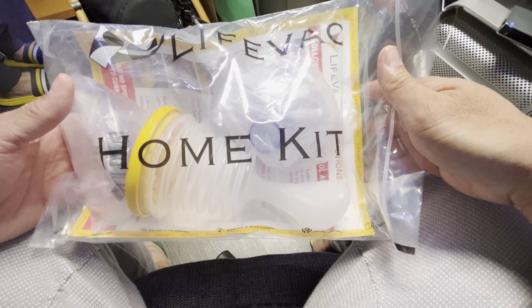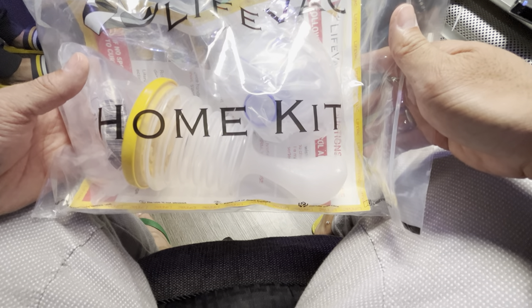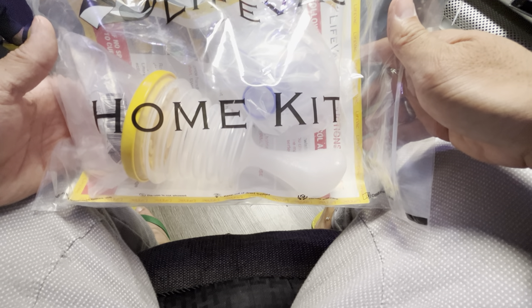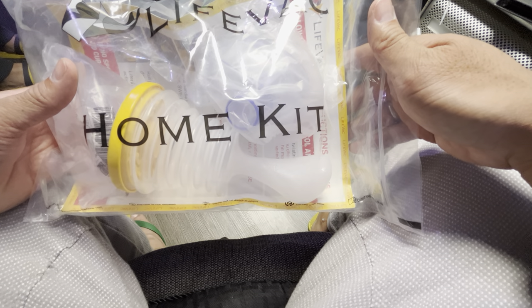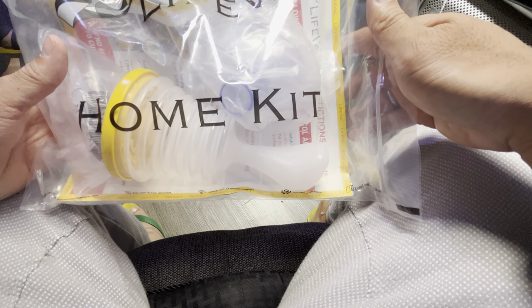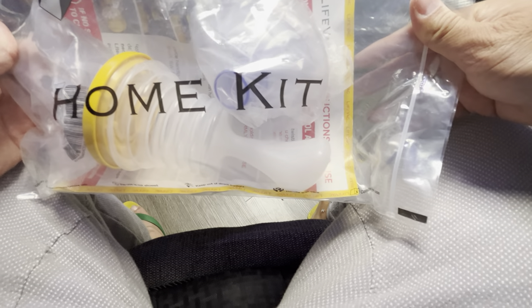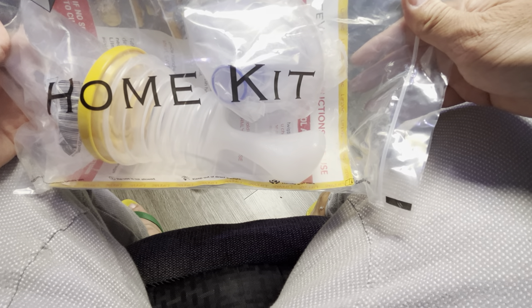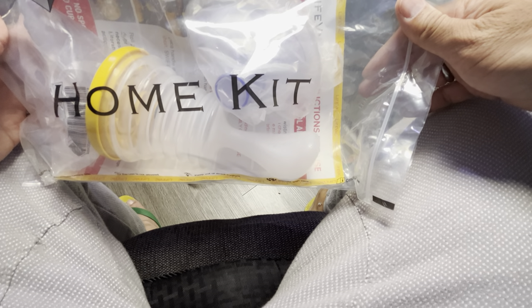We actually came across this on the internet. Having a baby, a nine-year-old, and us adults, you can come across points where you're choking if you don't chew your food properly. So for that sake of extra peace of mind and security, we've seen some videos on these things.